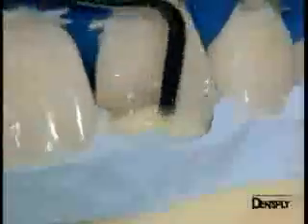A second application is made here. Care should always be taken not to extend the material to the edge, as we are working with a dentine shade. This is because we wish to recreate the translucency at the edge of the restoration with the enamel shade.